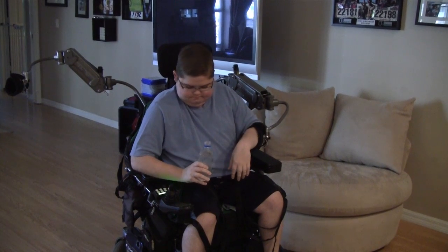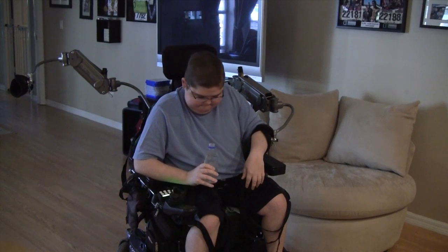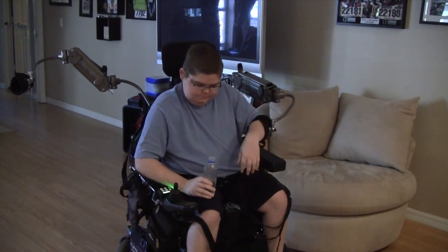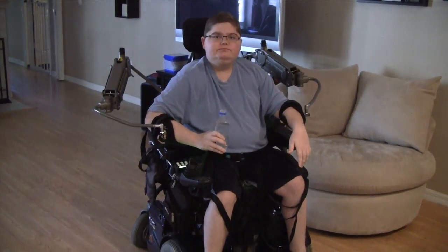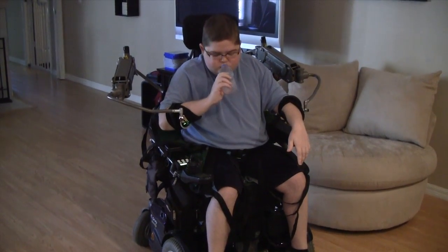Zach is holding a bottle of water in his arm and he's trying to drink it without the use of the mechanical arm attachment.